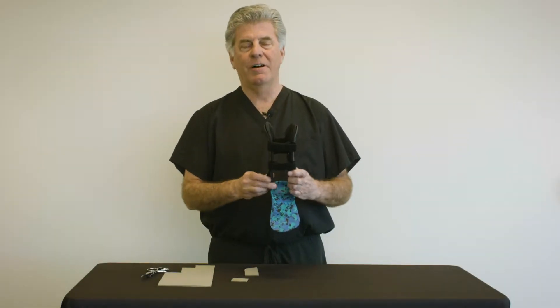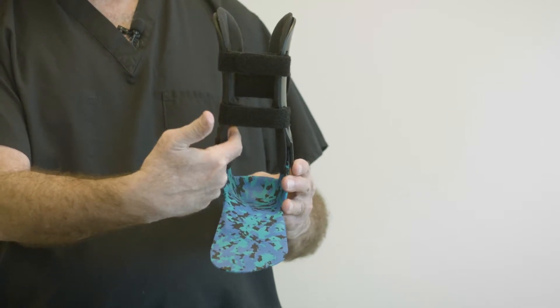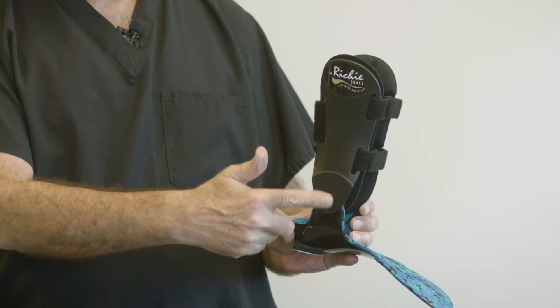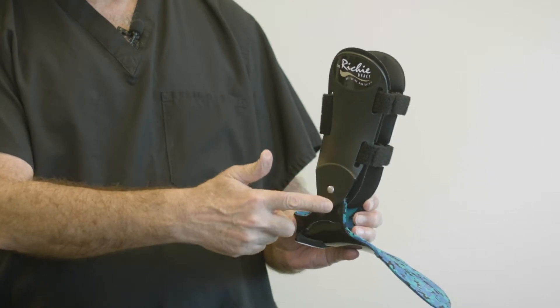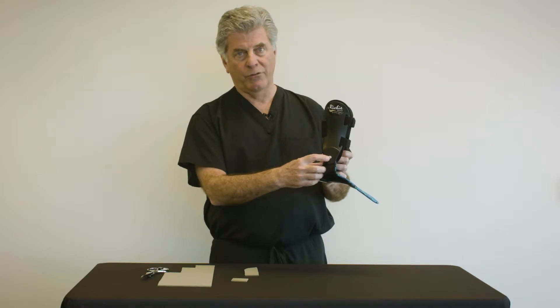If we encounter a fit problem with the Ritchie brace, most commonly it's rubbing of the patient's medial malleolus inside the brace along the medial aspect, most commonly right at the tip of the medial malleolus, which corresponds with the rivet portion of the brace. This rubbing occurs because the patient is pronating inside the brace, which displaces the distal leg and ankle medially.